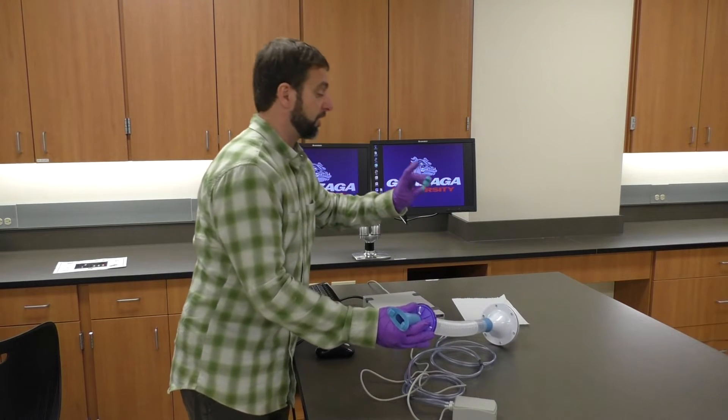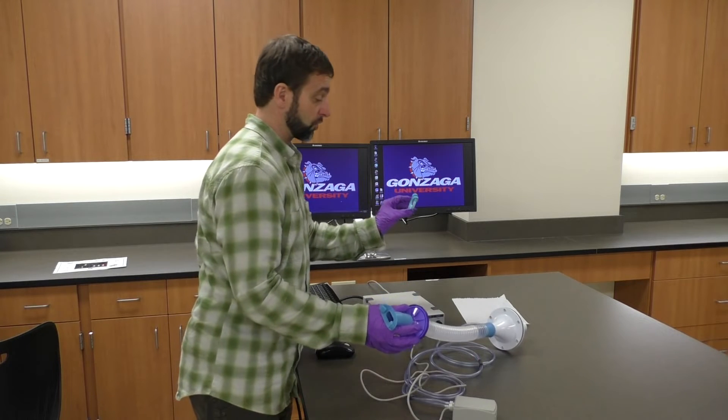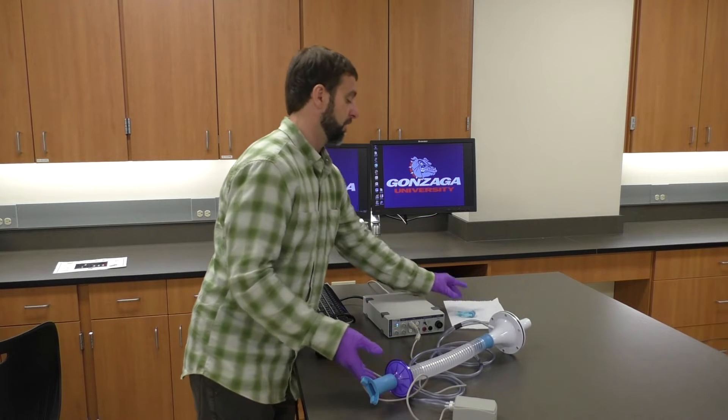The last piece we need is the nose clips. If you're doing this breathing exercise without the nose clips on, it's not going to work correctly, so you do have to wear the nose clips.